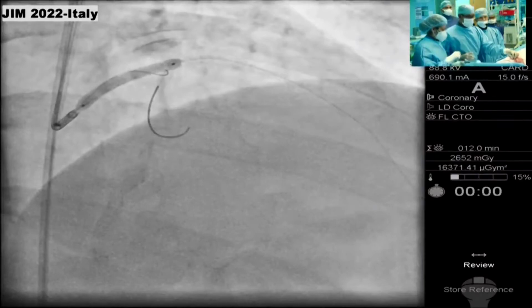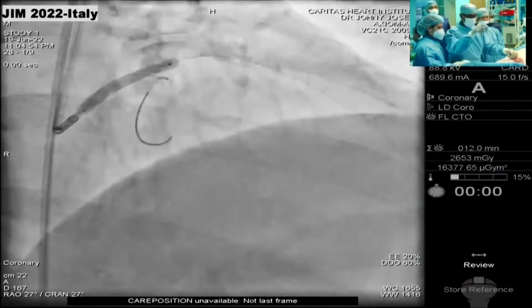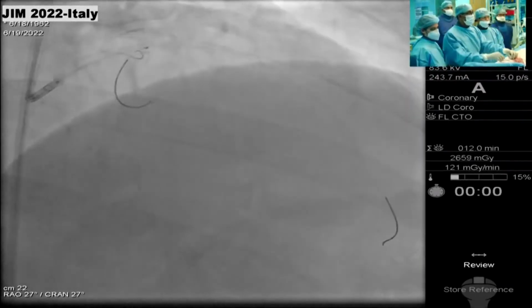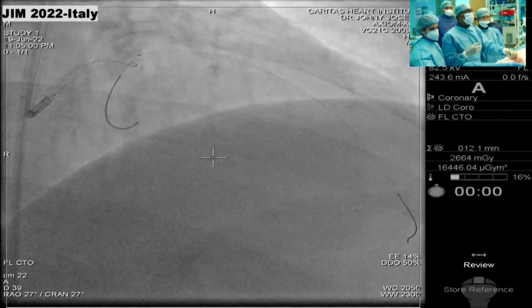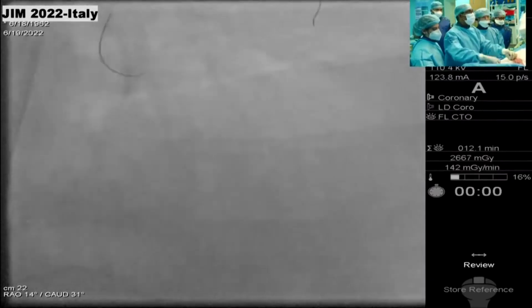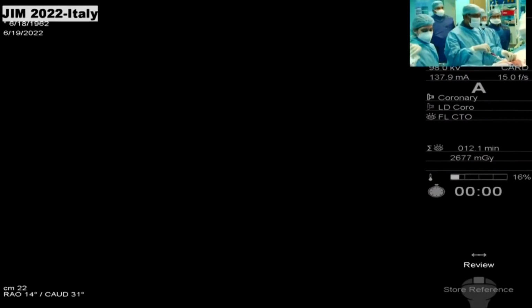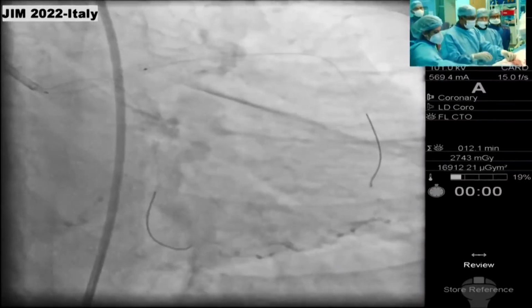Oh yeah, sure it will protrude, but I'm just saying that if you protrude 1 millimeter in a case like this one, not every case, this one, where the circumflex is 4.0 and wide open, I don't think it matters. So you can afford the little bit of protrusion. You can afford 1 millimeter protrusion. I mean, it looks nice.